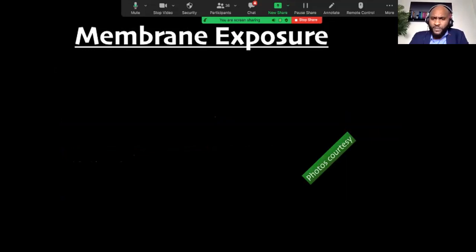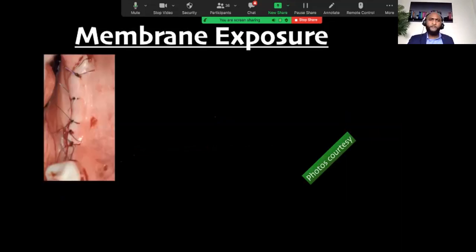Now, this is a picture, rather a series of pictures that are not my own. But what I want to explain here is sometimes you end up with membrane exposure. Now, one of the commonest causes of premature exposure of membranes, in 2-3 days, the patient comes back and tells you, I can see a white thing through my gum. What tends to happen is if you're stitching and you put your stitches too far apart, when the hematoma forms, this wound could all open up.